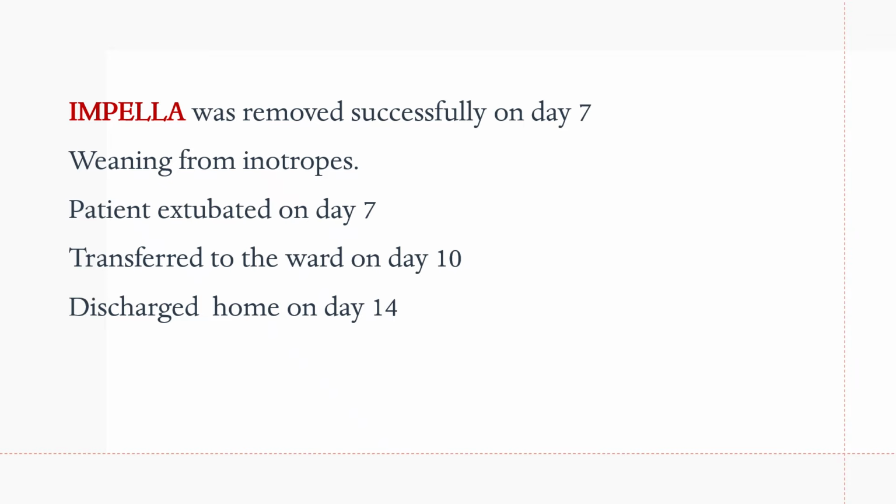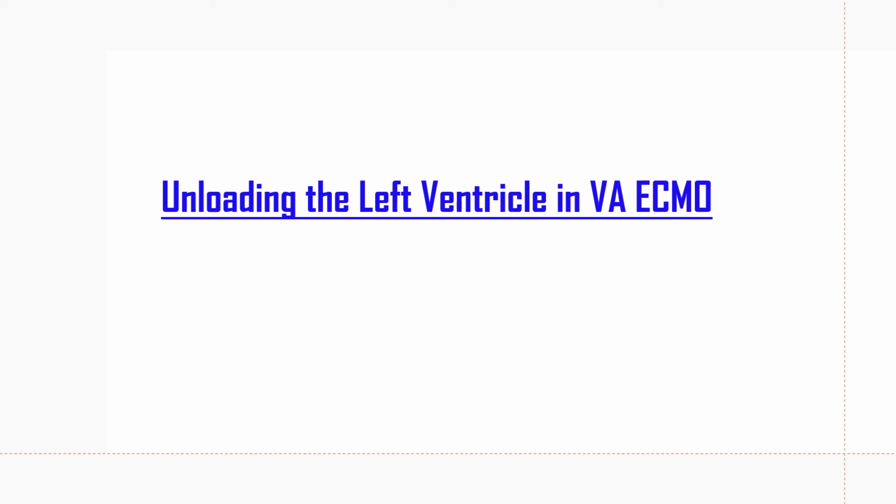On day 7, the Impella was removed, with weaning from inotropic support, and the patient was extubated on day 7, transferred to the ward on day 10, and discharged home on day 14. So now we are going to discuss unloading of the left ventricle in VA ECMO.